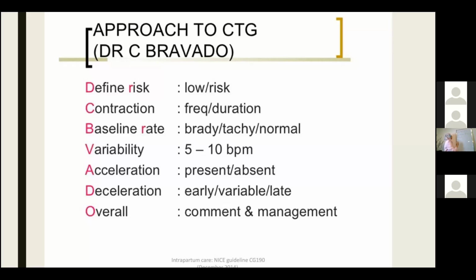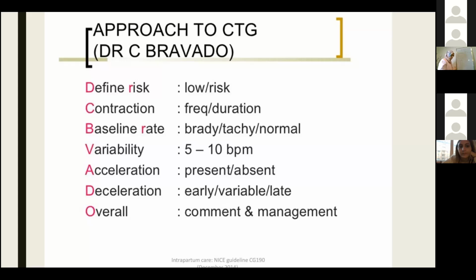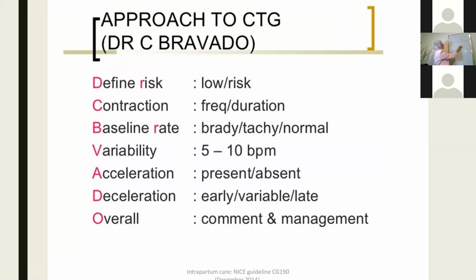Baseline rate, you have to define the baseline rate. You have to tell me whether there are accelerations in this CTG or whether there are decelerations. Now, what are they? Let me do it again. So we are defining baseline rate, accelerations, and decelerations.